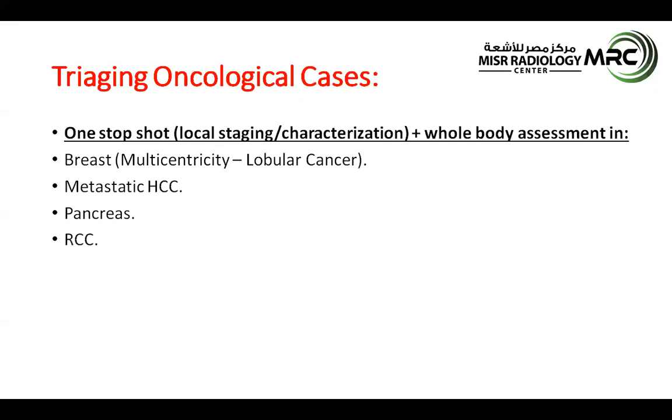There's also the renal cell cancer, and this is also where the integration of MRI may have an edge because of the normal excretion of FDG through the renal excretory system. So there could also be an element of obscuration of renal malignancies, especially when we're talking about small tumors. And again, the integration of MRI helps in further characterization and assessment of extent of involvement.